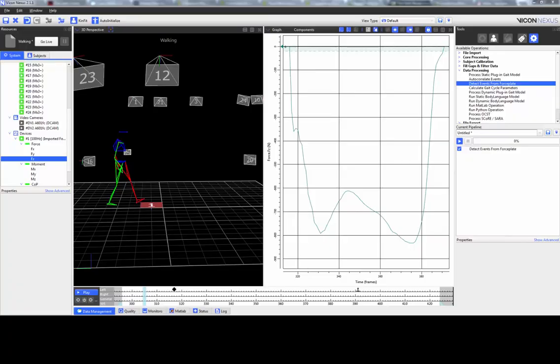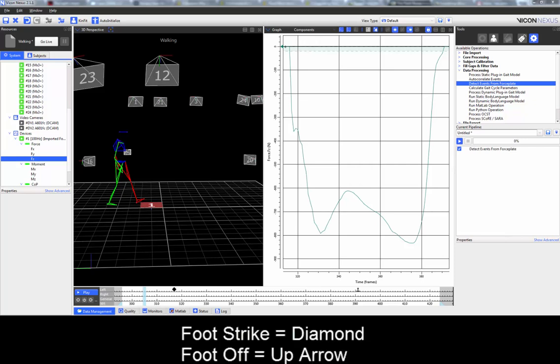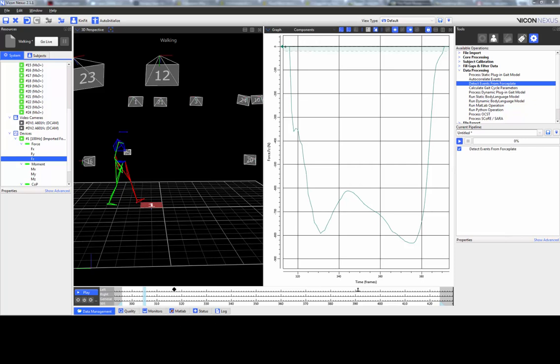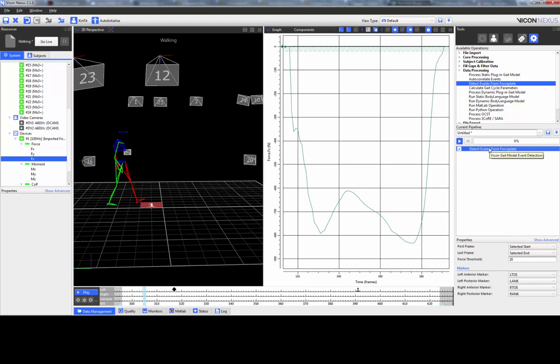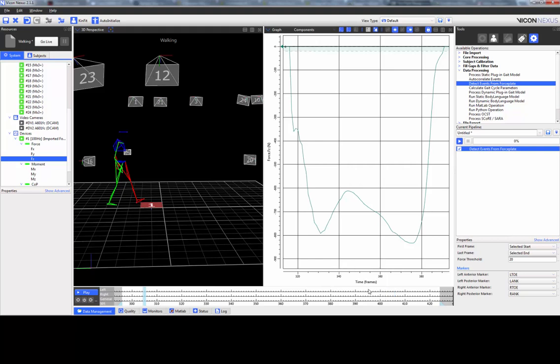The Detect Events from Force Plate pipeline operation automatically detects the foot strike and foot off events using the force threshold from the FZ channel and the designated markers. You can adjust the force threshold and the left and right anterior and posterior markers. In this example, I'm going to clear my events and change my left posterior marker from the left ankle to the left heel.